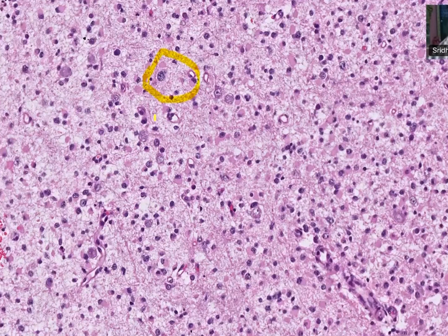Can you see the cell inside this? How do you describe it, Anita? What is this cell and what is this cell here? Is this cell and this cell the same?